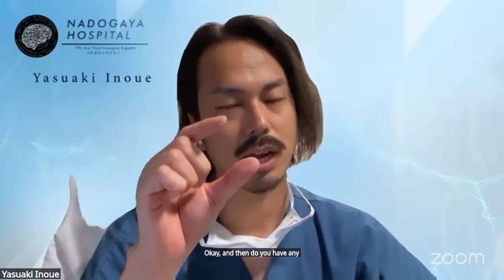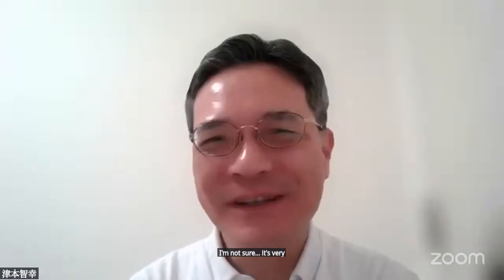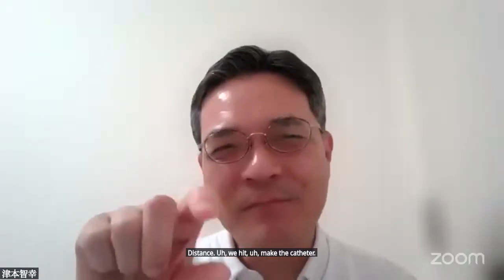Okay. And then do you have any specific distance from the tip of the heat gun to the microcatheter? I'm not sure. It's very difficult to say, but I use a 10 centimeter distance. We heat the microcatheter from the tip of the heat gun.